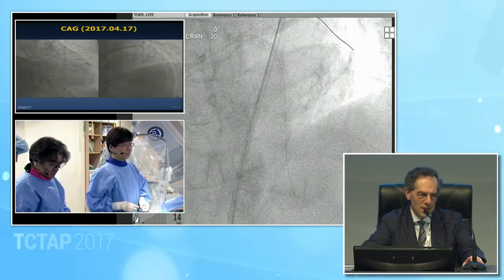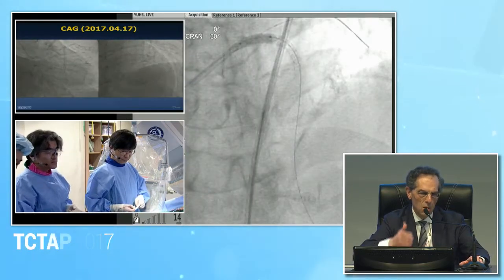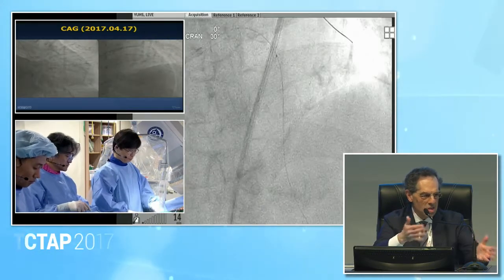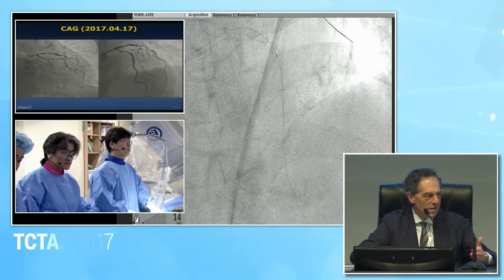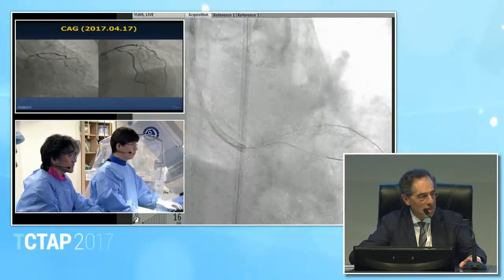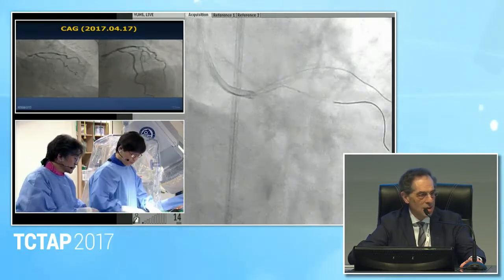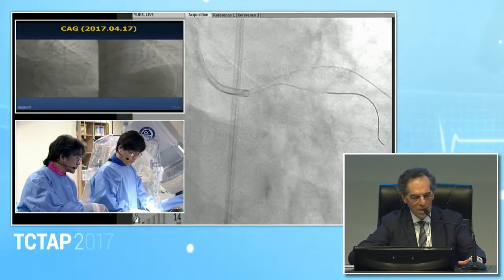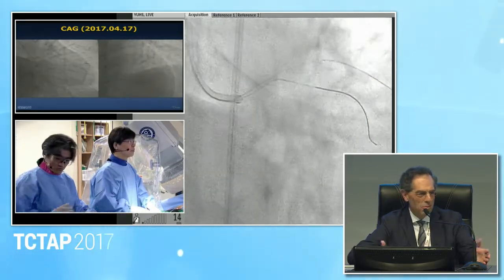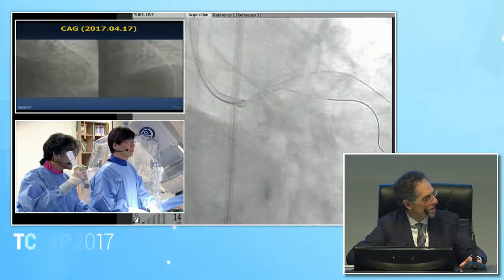We think that, based on both the longitudinal view and the cross-section, we must base our decision on measurements. Instead of asking every time for the MLA and how big it is, we would like an advanced software that can immediately give us this measure. There are already significant advantages with the recent software, and it is more practical than speculating on moving images and a single cross-sectional view.